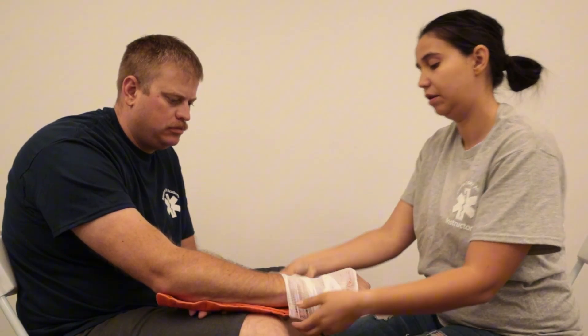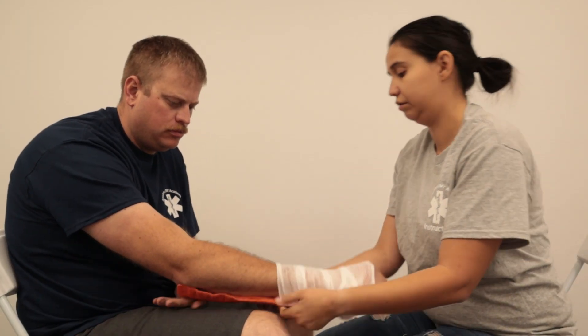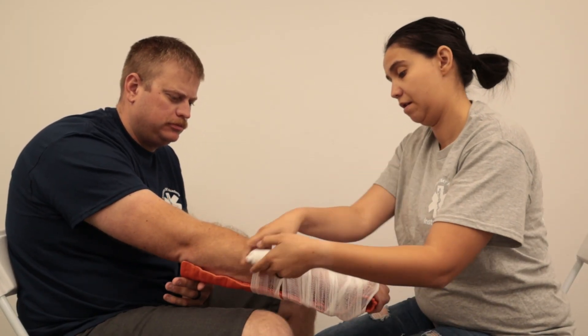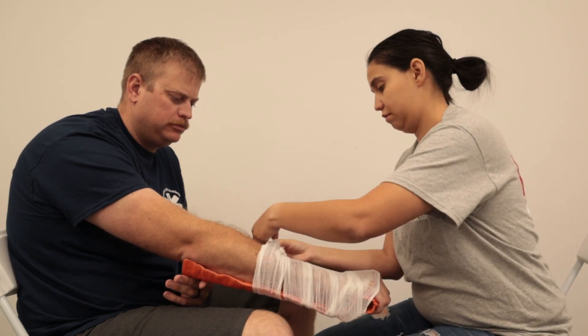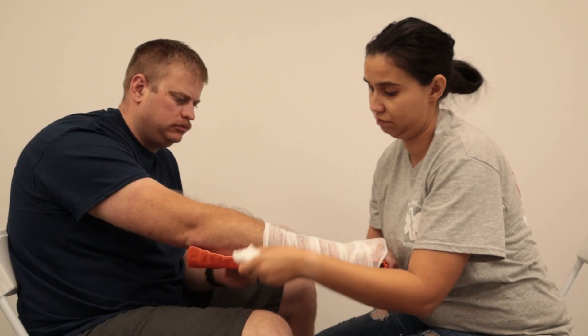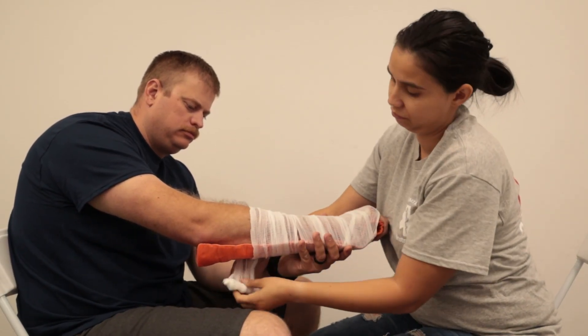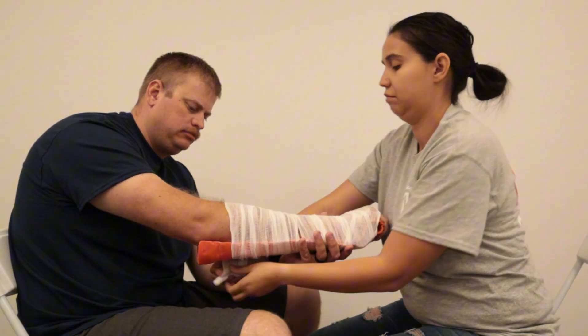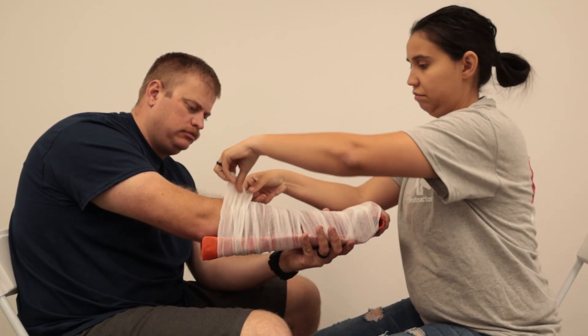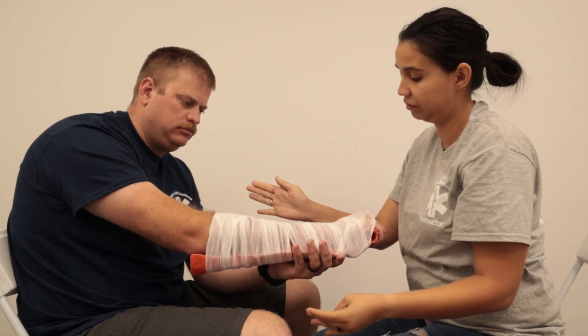We'll wrap it — not too tight to cut off circulation, but enough to secure the splint to his arm. Then you can seal this off with tape, or some of them are self-adhesive. Is that comfortable?